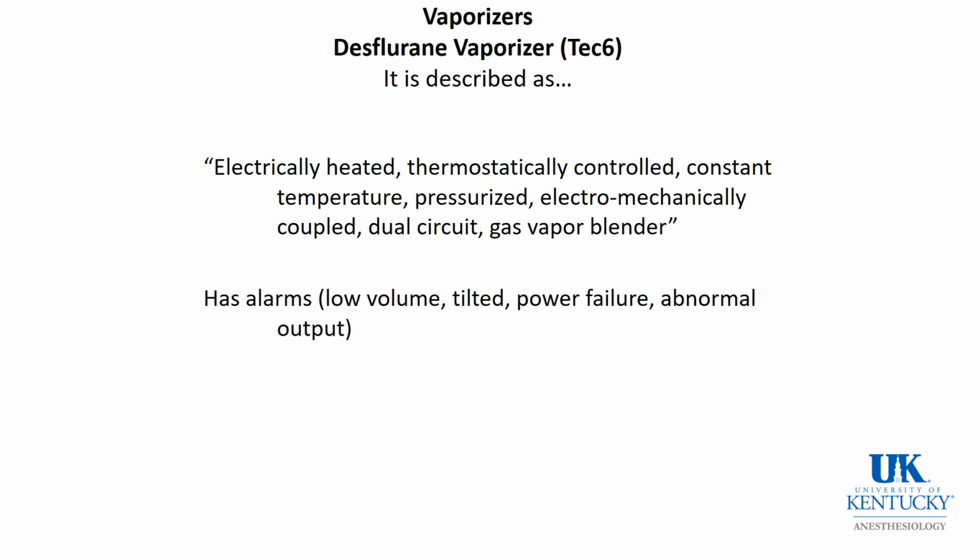Therefore, they had to develop an entirely new vaporizer, and it's described as an electrically heated, thermostatically controlled, constant temperature pressure, electromechanically coupled, dual circuit vaporizer.